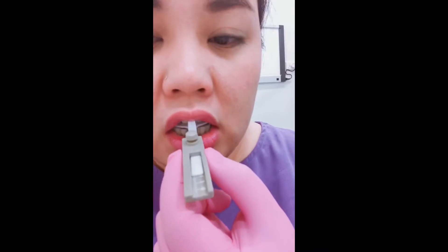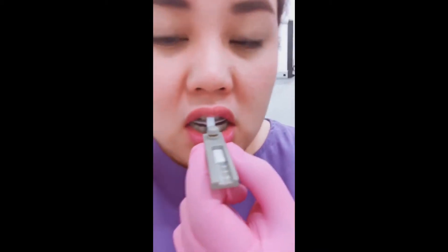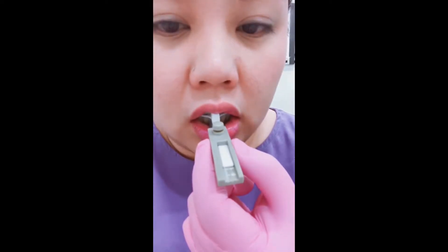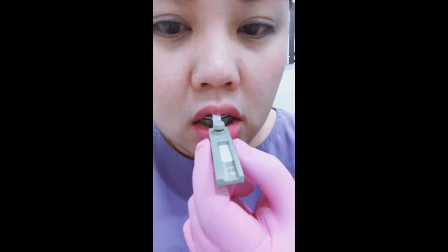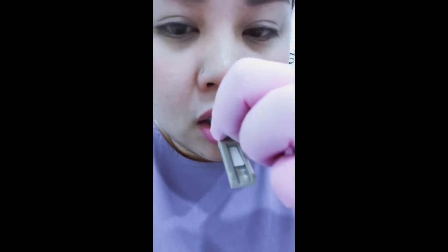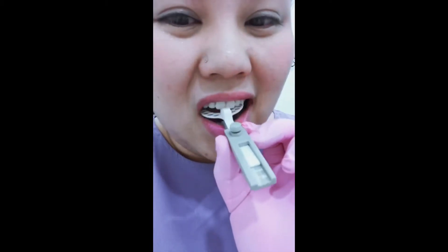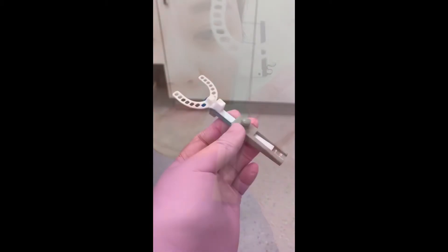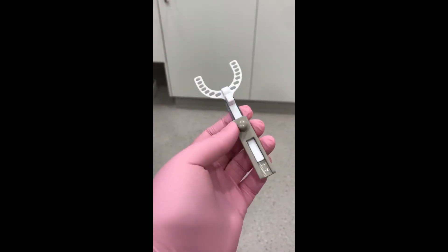While firmly biting into the notches, I'm sliding my jaw as far forward as possible and as far backward as possible. I'm repeating this three to four times to ensure consistency. Take note of the positive and negative readings. You can add these two numbers up without regard to the plus or minus sign — this total is the protrusive range.